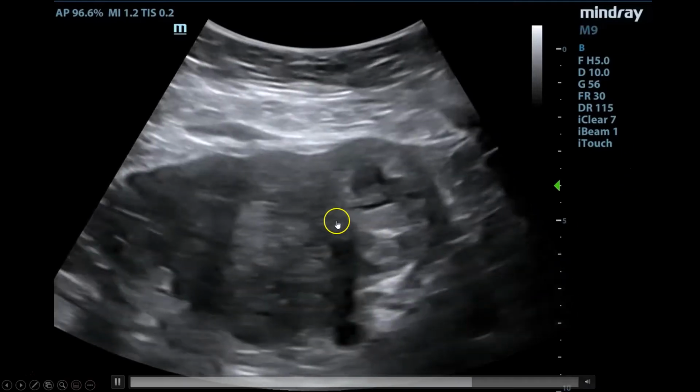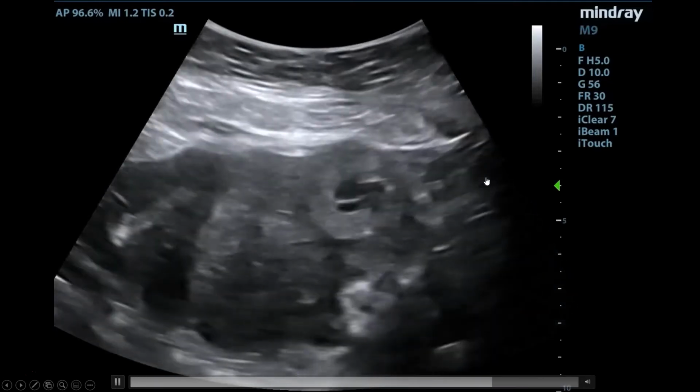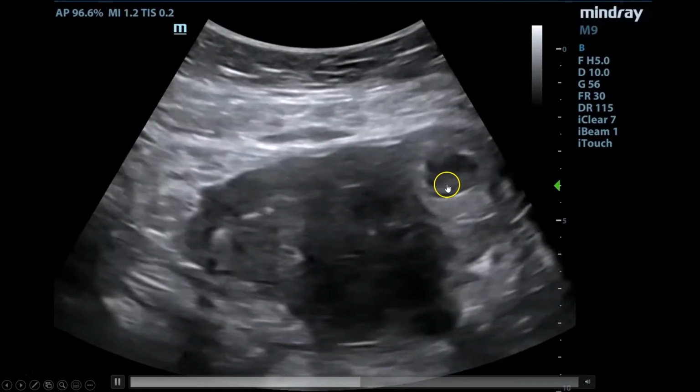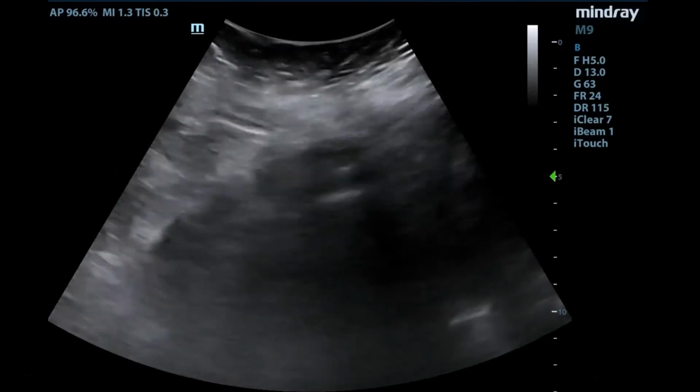Like one would expect typically that this type of pregnancy be located more in the middle of the uterus, not really off to this edge. So that's a little concerning. And then if this is oriented correctly, this is almost off towards where the left ovary would be, or at least in the left adnexa. So this is concerning. I'm not sold that this is an intrauterine pregnancy.